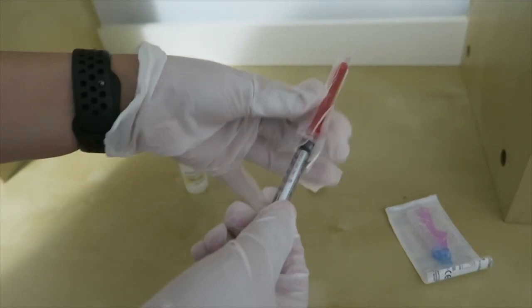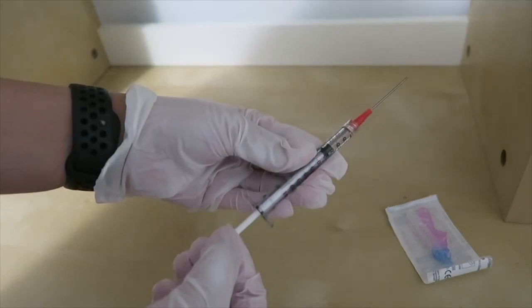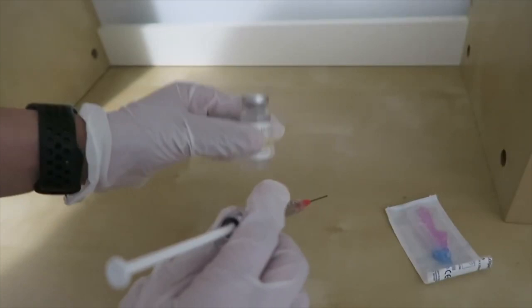And safely recap the needle. So now I am drawing up 1ml of air into the syringe. And I will take this air and inject it into the vitamin B12.